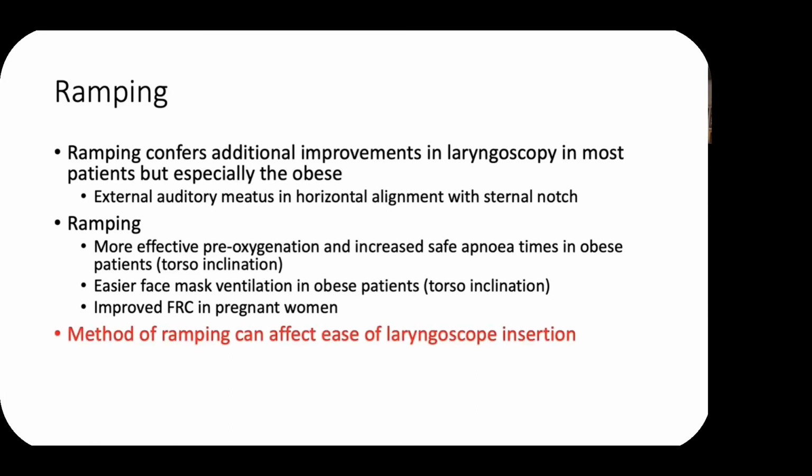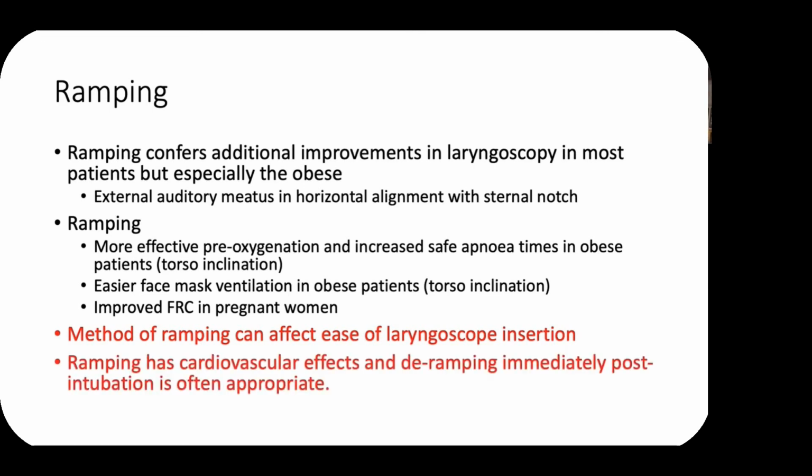A further key thing to understand is that the way you ramp a patient will affect the ease of laryngoscope insertion, and I'll address this in a moment. When using ramping, it is important to bear in mind that ramping has cardiovascular effects, and deramping immediately post-intubation is often appropriate.